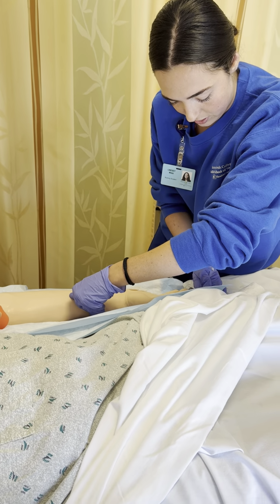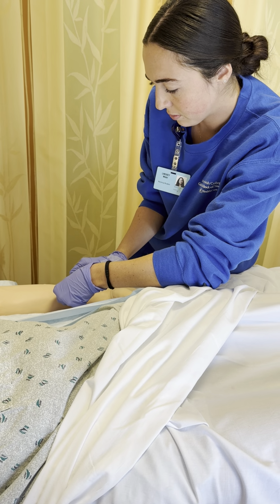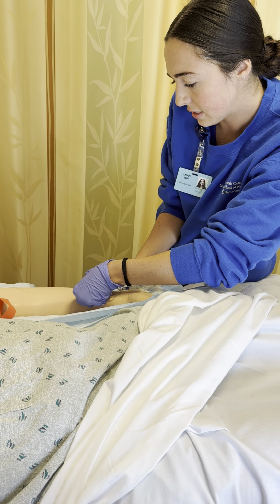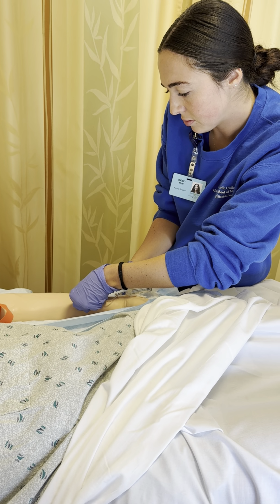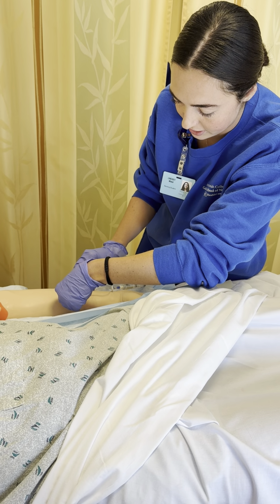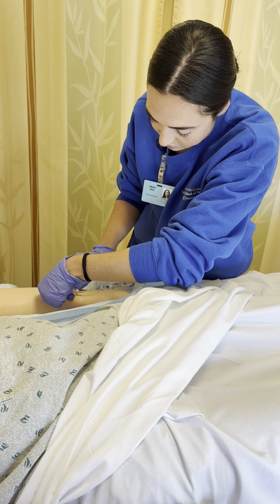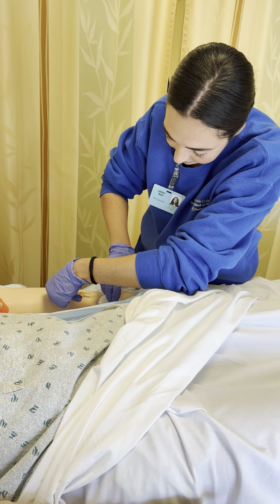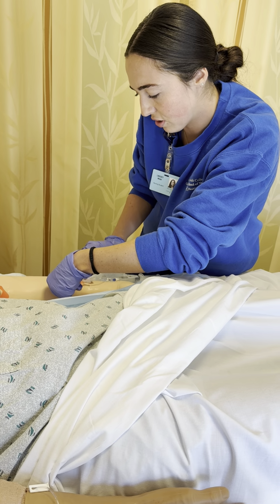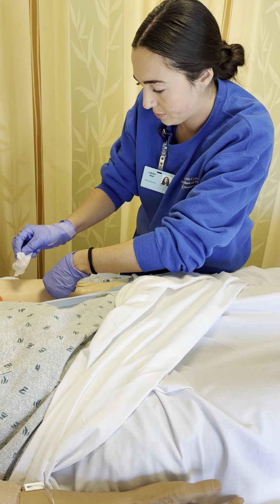I'm going to grab my J-loop and put that on nice and tight. Okay. I'm still securing that area there. I'm going to take my piece of gauze and wipe away any excess blood to make sure that it has a nice dry surface for our securement tape to stick on.